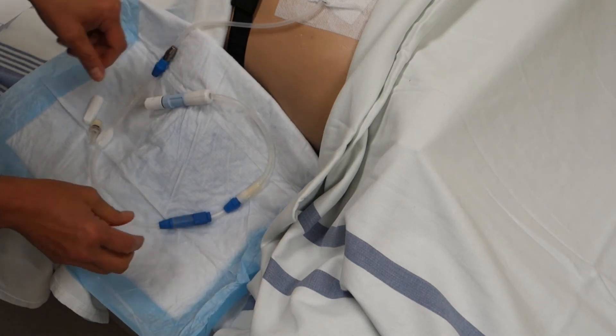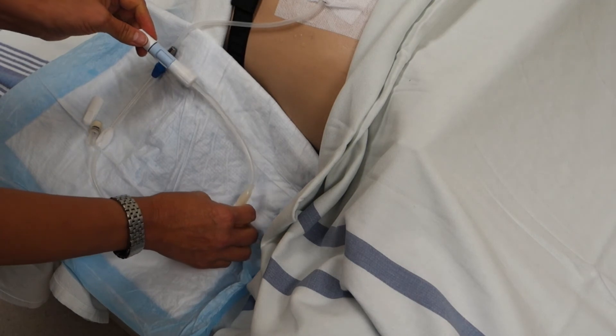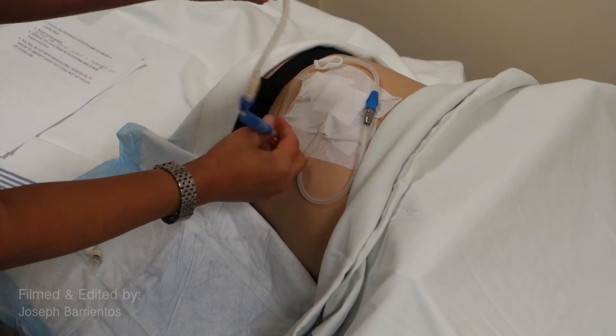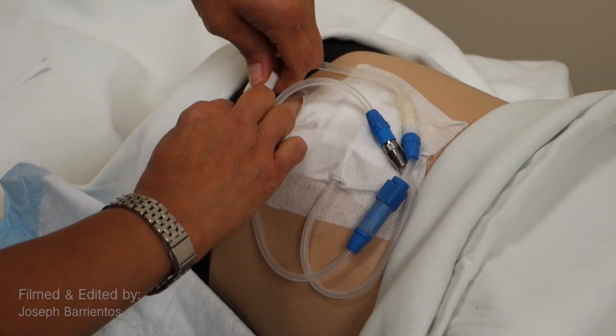You now have a converted Fresenius catheter extension to a Baxter transfer set. Remember this line becomes very long — ensure to secure it so that it is not being pulled on or tugged on.